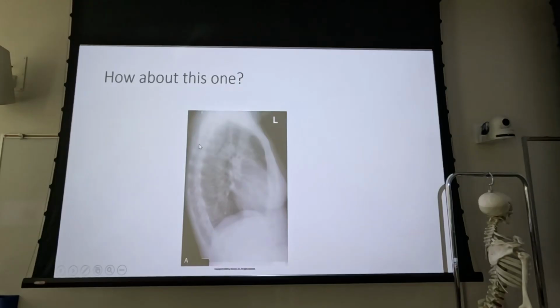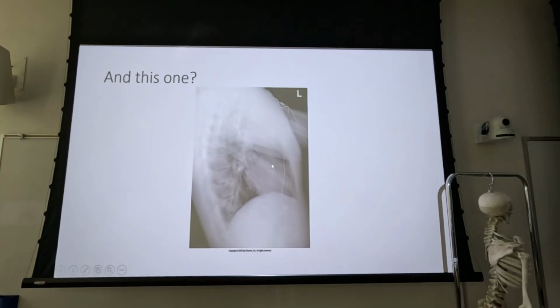So this is kind of a unicorn in a lot of different ways. No gastric bubble, and I can actually see where the heart is extending beyond the mediastinum. How about that? Soft tissue of the arms. That's just bad soft tissue of the arms. What was that? An attempt at a portable lateral chest X-ray? I don't know.